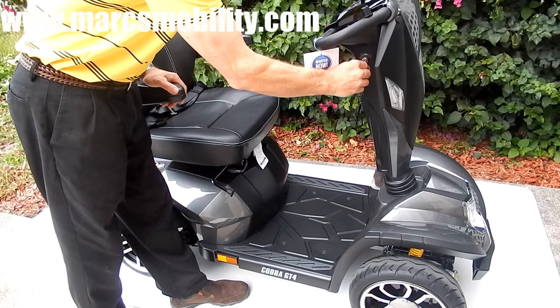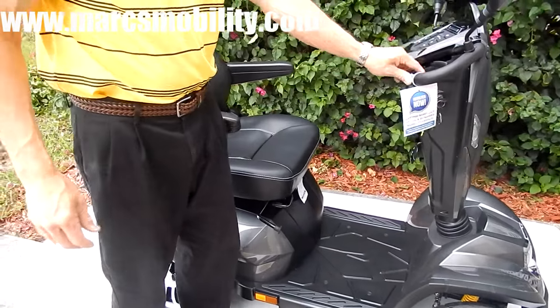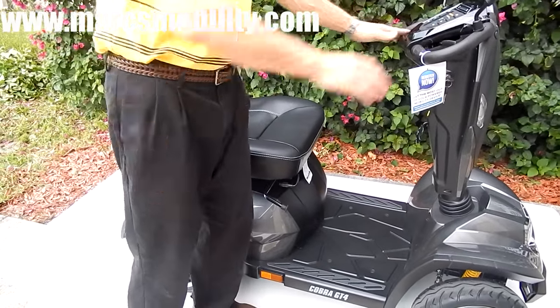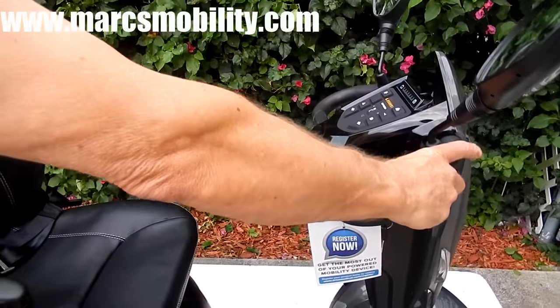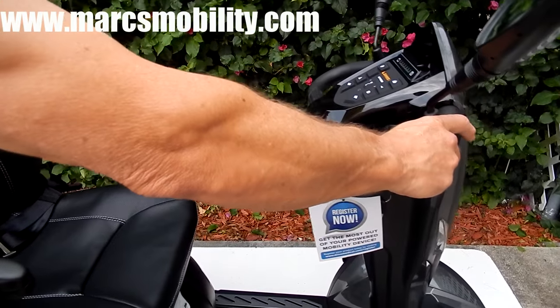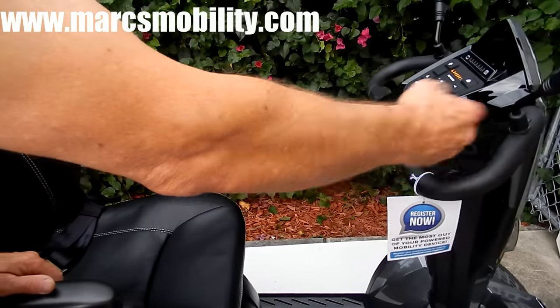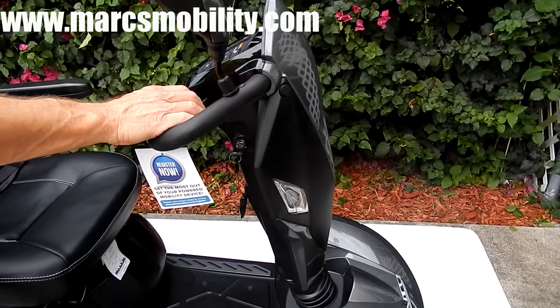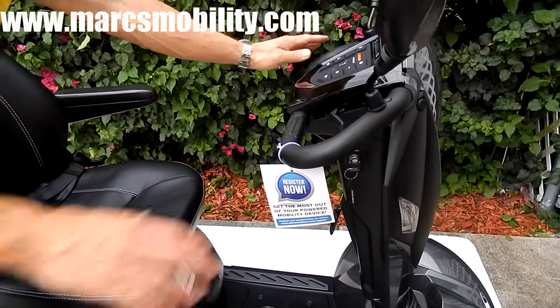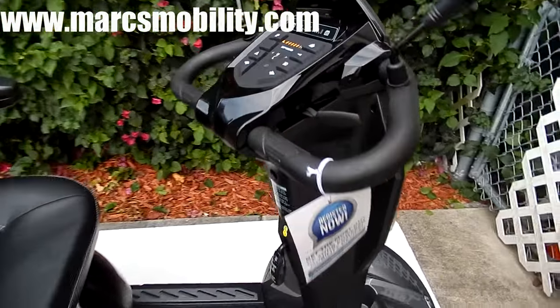The nice thing about these types of scooters is you can drive them whether you're right-handed or left-handed. If you only had one arm or one hand, you can drive it this way for forward, or this way for backward, all on one side. You can do both forward and backward on both sides, which is nice with these types of tillers.